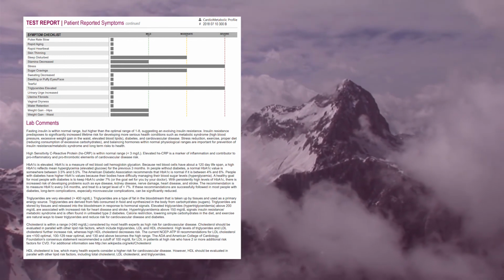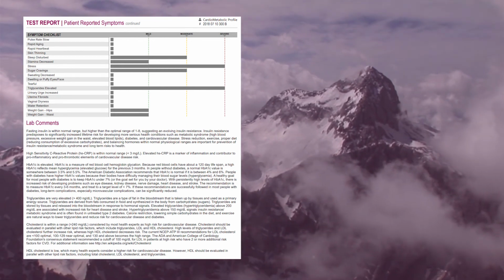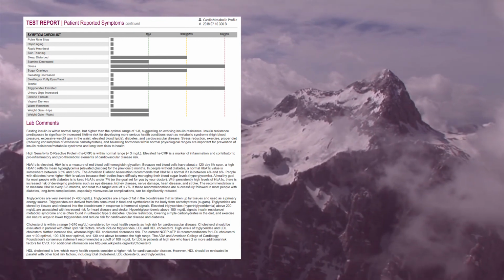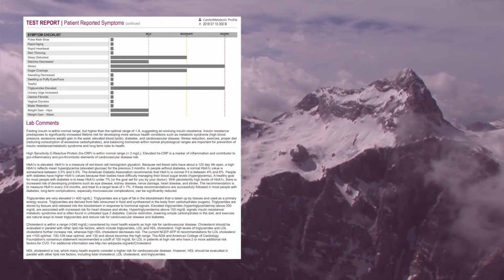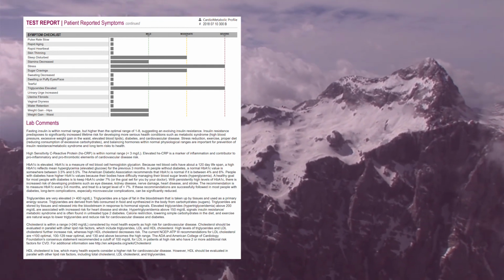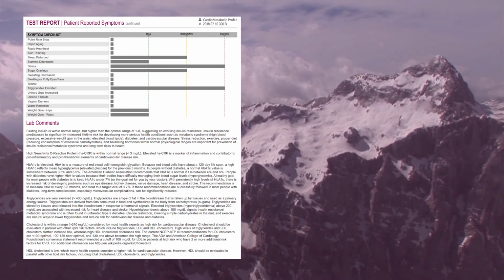Lab comments will talk about their findings of their lab results, how it falls within the range, what that indicates for their health risks, and potentially some treatment considerations of how it could be modified. And that is our report.